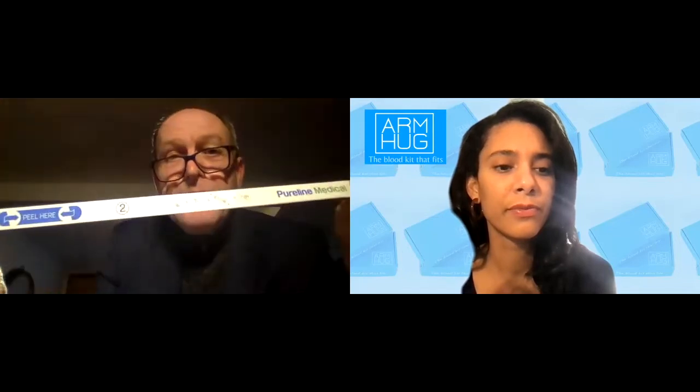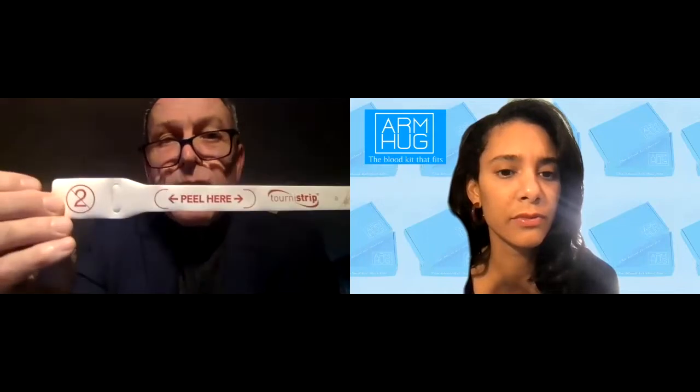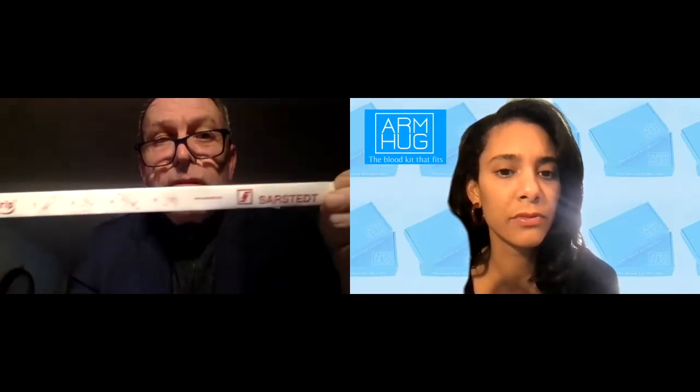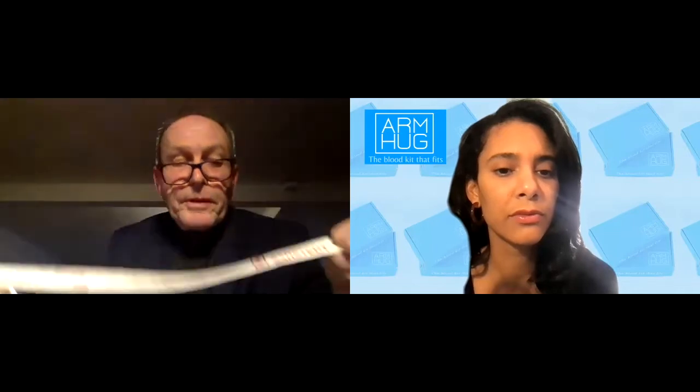From a company point of view, we can print anything. This is for a hospital group in the Middle East — it's beautiful. And this is for a very big phlebotomy company, Sarstedt — probably one of the biggest phlebotomy companies in the world. So we can produce things like that. We can brand the products as well.